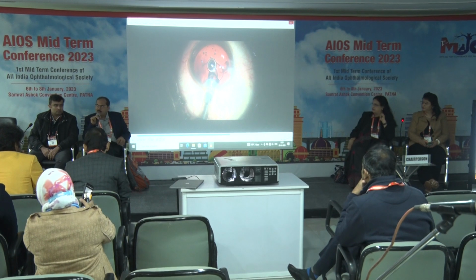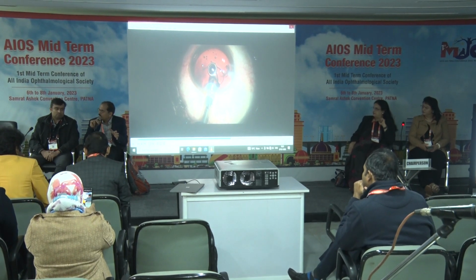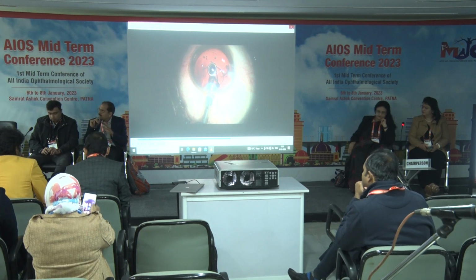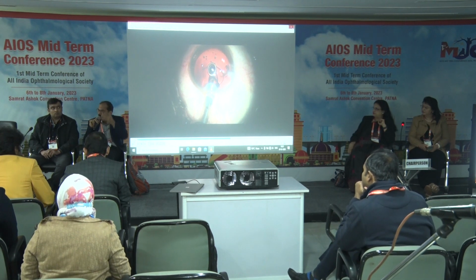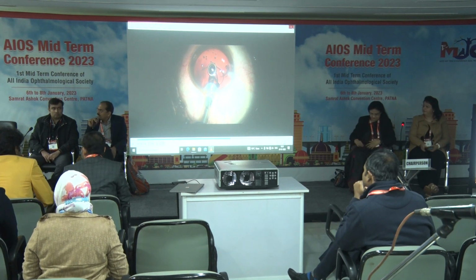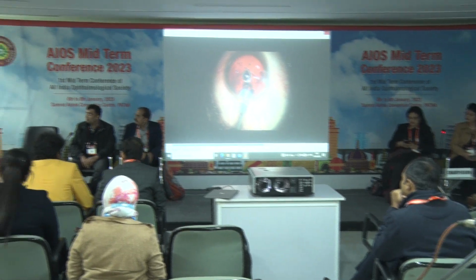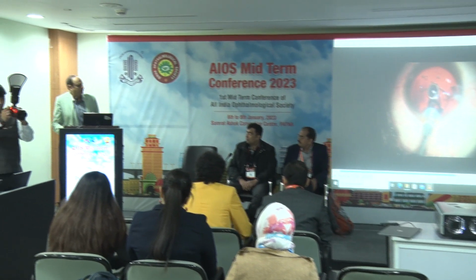I think thanks to the imaging techniques our insight has also become broader. Now we know exactly which are the outliers and the selection criteria, and maybe the initial enthusiasm died down in the wake of the wisdom of all the complications coming up. And especially now the only bugbear is going to be a plateau iris, where the iris configuration is not actually what is seen on a slit lamp.